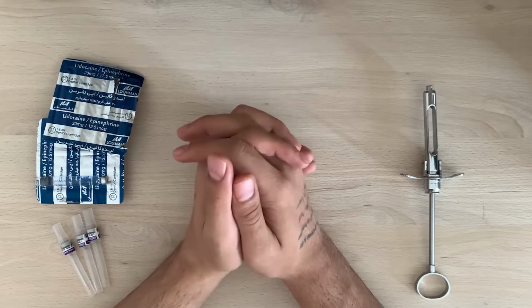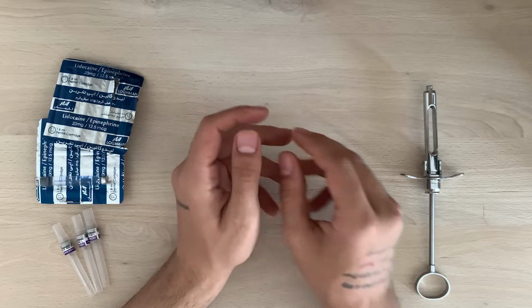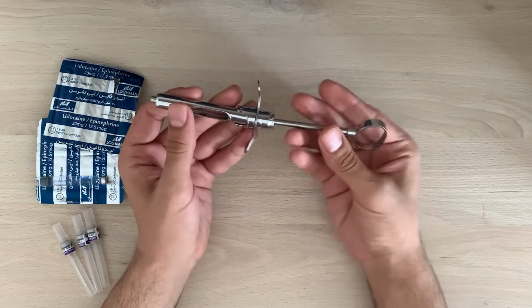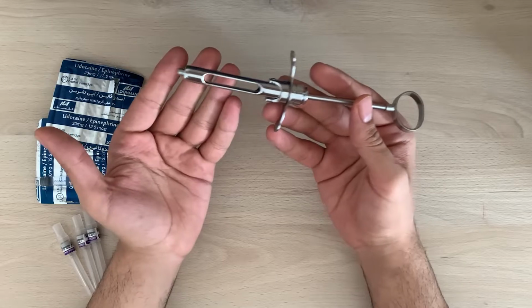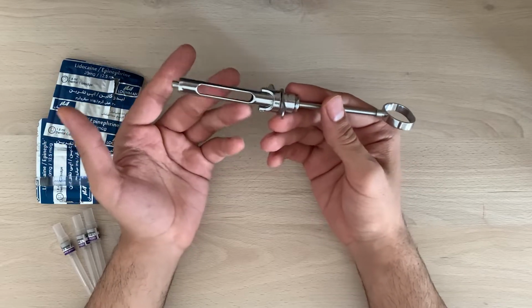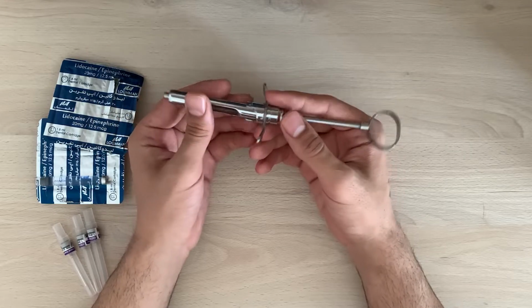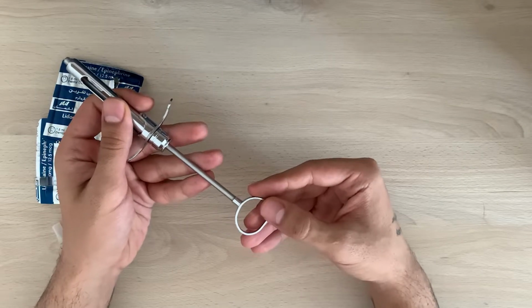I'm a dentistry student. In this video, we will learn the different parts of a dental syringe and also how to assemble it. A dental syringe is used for numbing the area where the treatment is needed, as part of preparation for actual oral care procedures. Okay, let's check the different parts of a dental syringe.